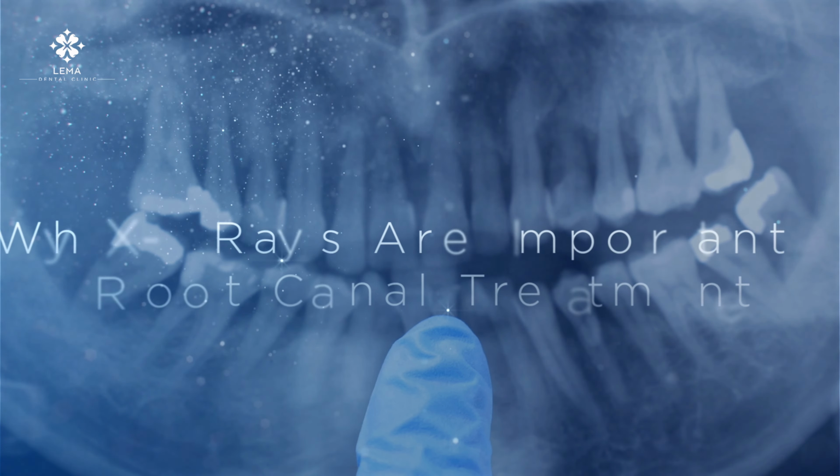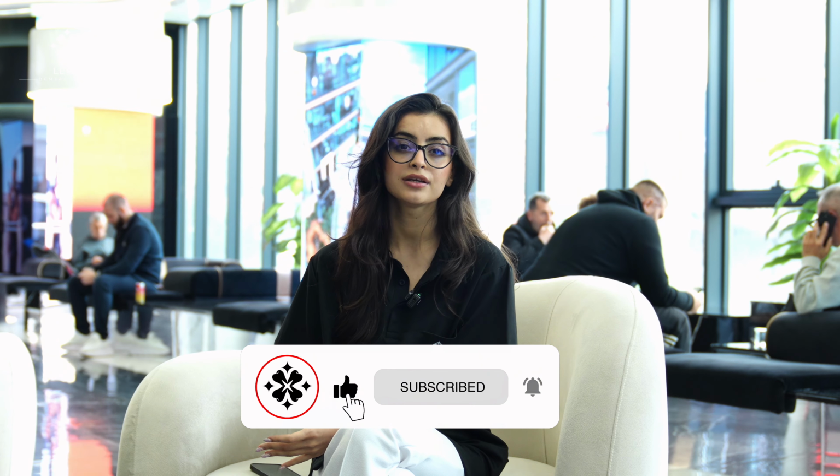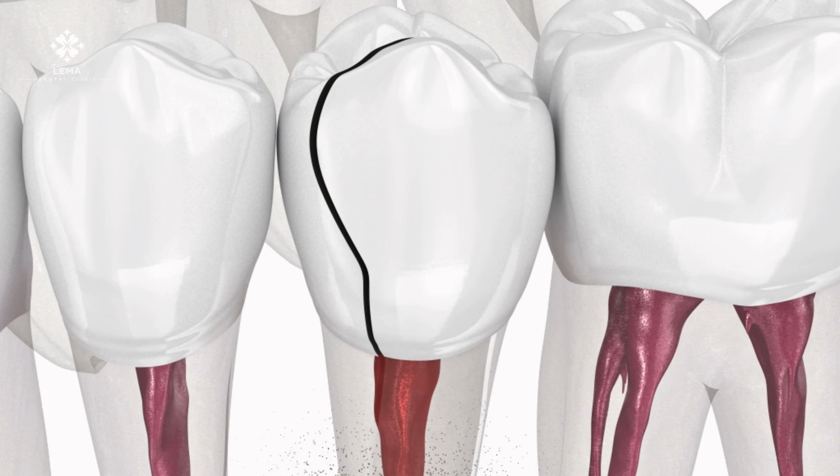Why X-rays are important in root canal treatment. X-rays play a crucial role in a root canal treatment by providing a clear and detailed image of your teeth, roots, and surrounding bone structure. They help your dentist assess the extent of the infection, locate any damage or cracks in the tooth, and evaluate the health of the bone around the tooth. Without X-rays, it would be much harder for the dentist to determine the best course of action for your treatment.